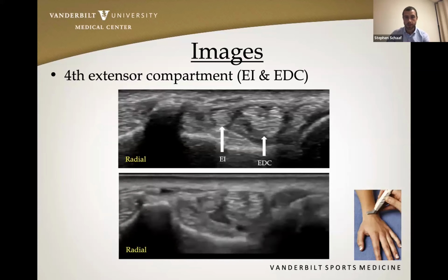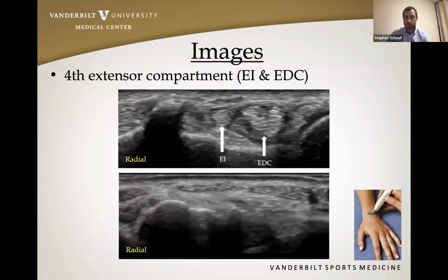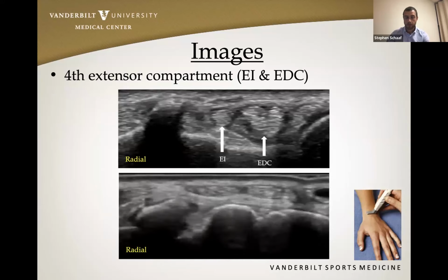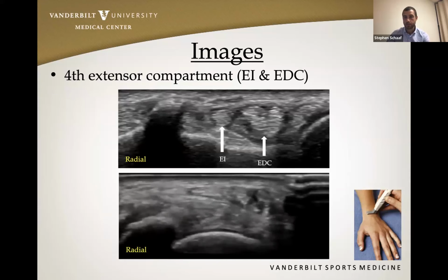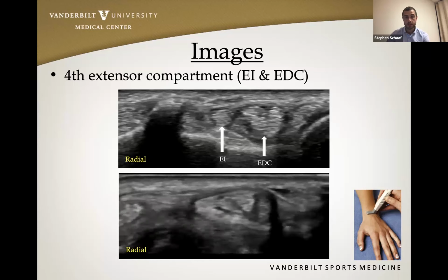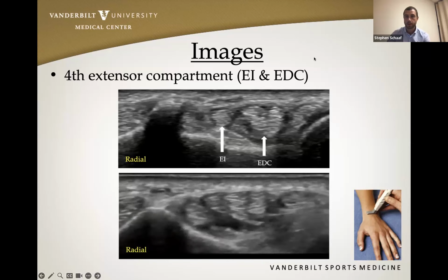So we see those tendons sitting at that home base, but additionally, we'll continue to scan those down distally. Once again, evaluating for any type of tendon tears or tenosynovitis that might be causing any type of popping sensation for this patient. But once again, we weren't seeing any abnormalities in this compartment either.